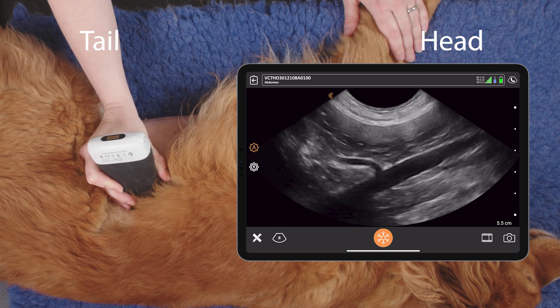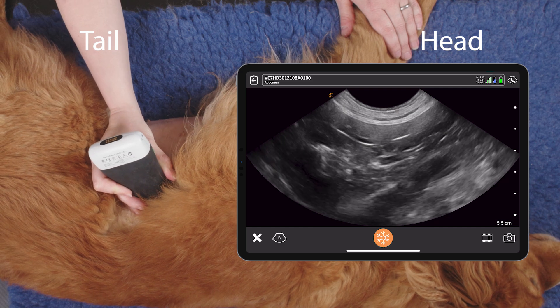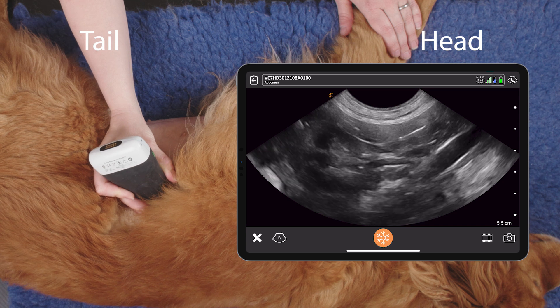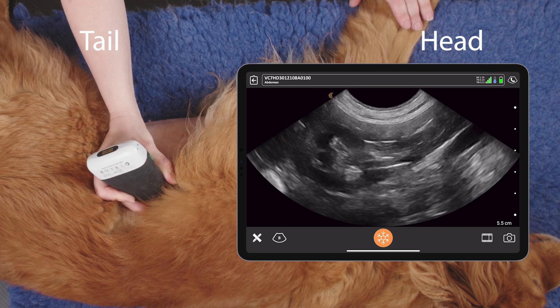We can then follow that cranially until we get to the left renal artery. Pippi has two left renal arteries, and then there we can see the left adrenal gland.